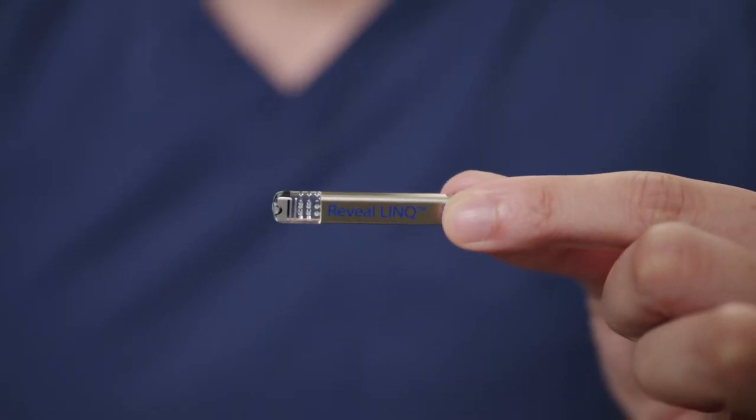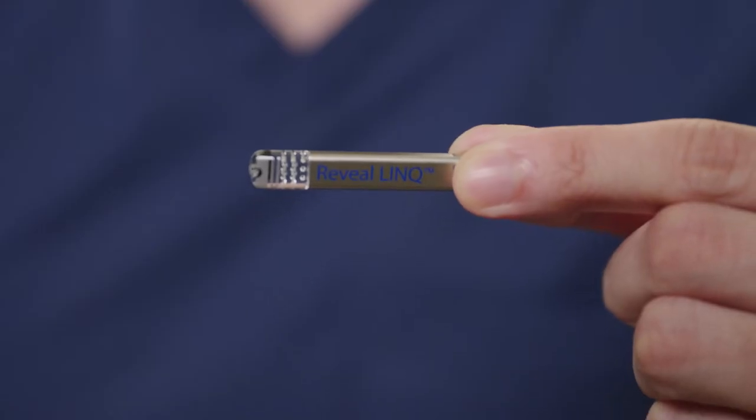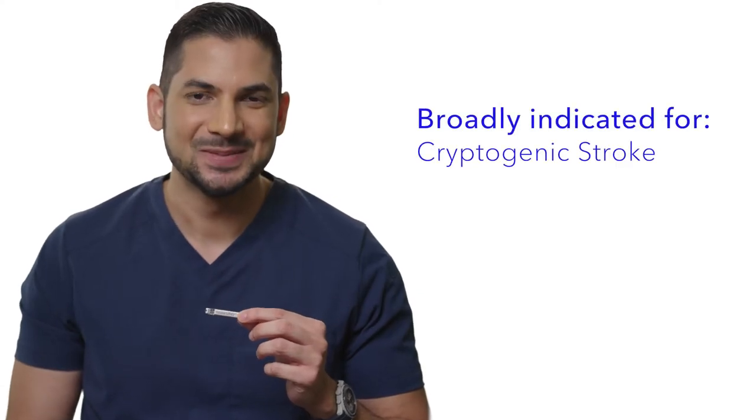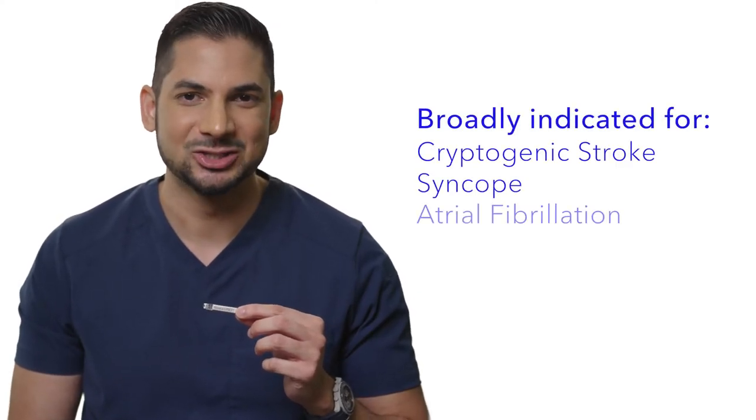During that time, I've inserted over 300 insertable cardiac monitors and today it's my pleasure to welcome you to this presentation on Medtronic's Reveal LINQ ICM. The Medtronic Reveal LINQ is about a matchstick in length and two credit cards thick. The battery life is indicated for three years and it is MRI compatible with 1.5 and 3T. There's no wait time necessary after insertion for an MRI. The device is broadly indicated for cryptogenic stroke, syncope, and atrial fibrillation patients.